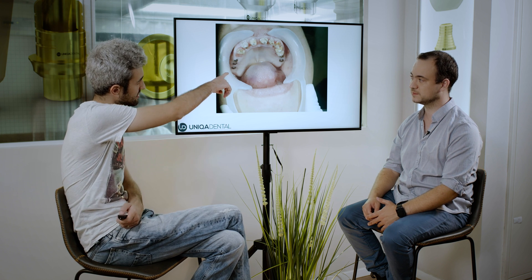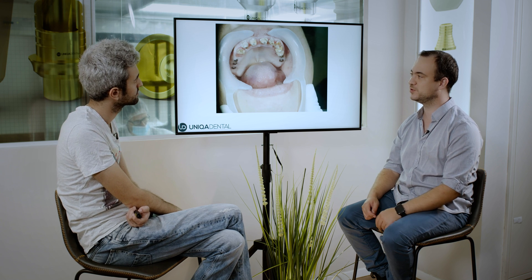Are these multi-units screw retained? Yeah, on multi-units they're screw retained — all the bridges that were made a long time ago probably.